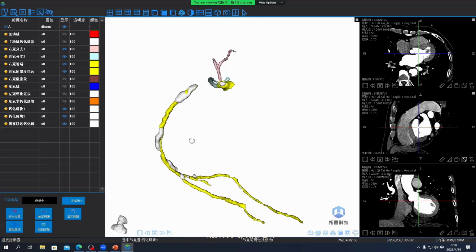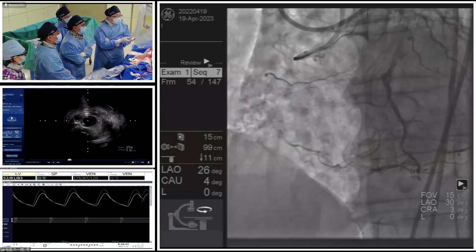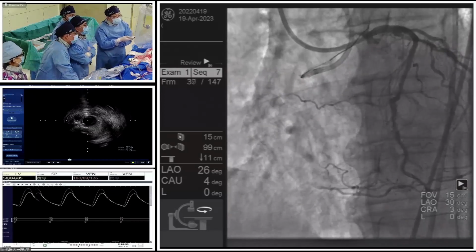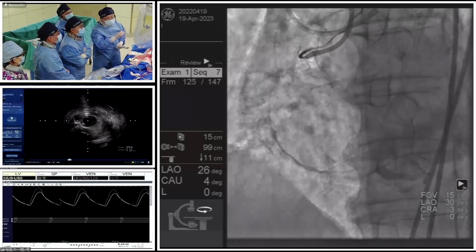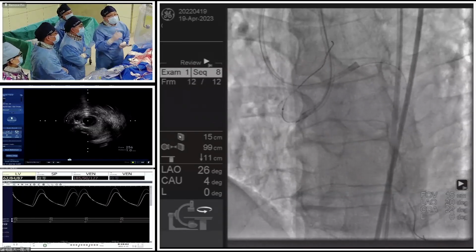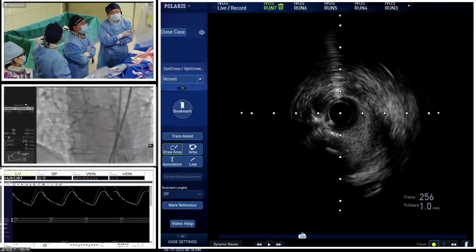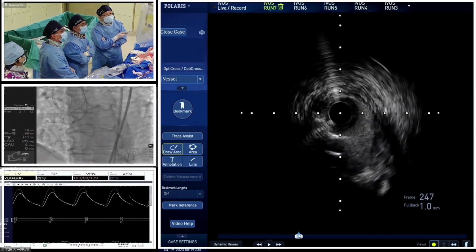So for this case, we did a bilateral angiogram. So let's see the bilateral angiogram. We can see in the distal RCA a diffuse lesion with calcification, and no stump. So firstly, we decided to use IVUS to find where the ostium of the RCA is. So to the audience, the IVUS, please. Please let Dr. Cao Yang introduce the IVUS.